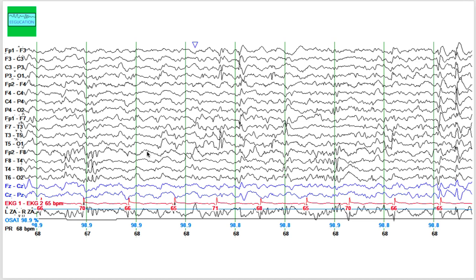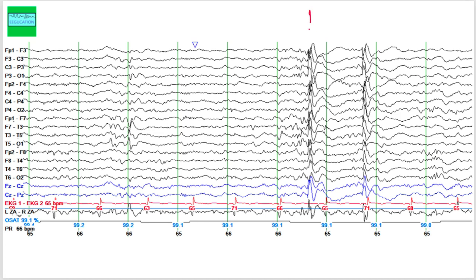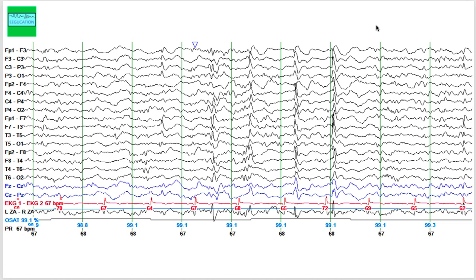Now we do not see the muscle or the eye blink artifact — the patient is asleep. We are noticing sharp waves seen independently: in the right temporal head region, in the left frontal-central head region, seen independently on both hemispheres as well as in generalized distribution. There are also generalized poly spikes, an independent sharp wave in the left temporal head region, and more generalized bursts of sharp waves. The background is slow and these sharp waves are more abundant in both hemispheres as well as in generalized distribution during sleep.